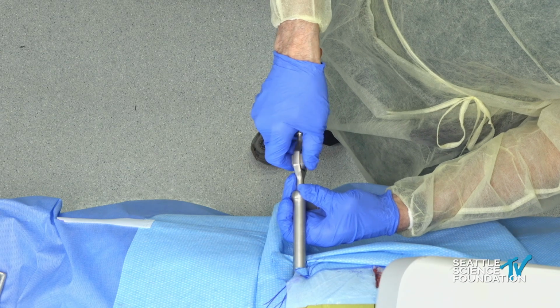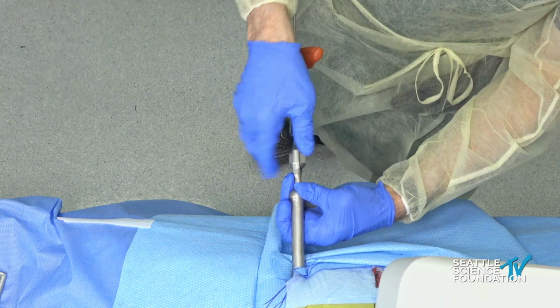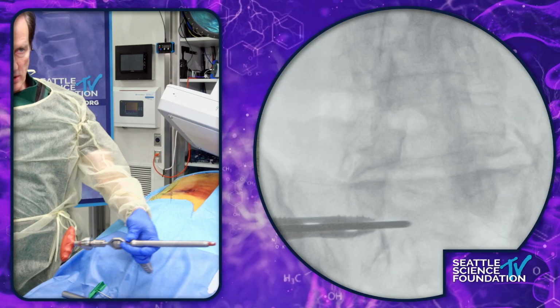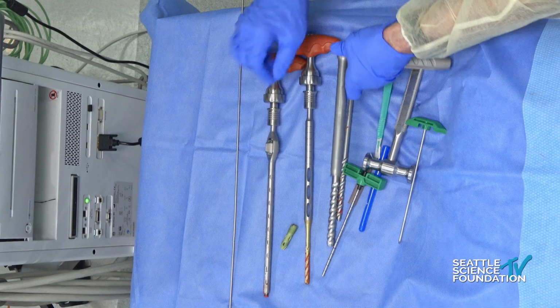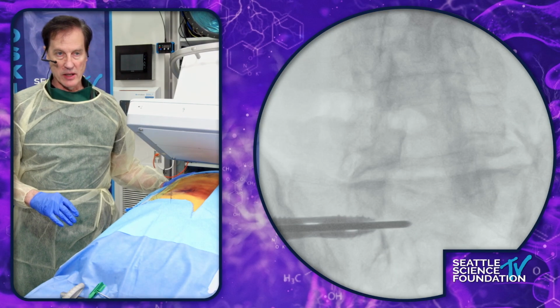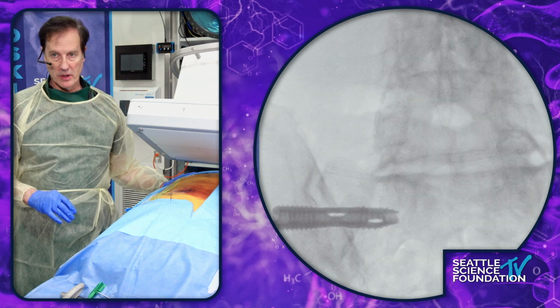So I'm going to disconnect here. I want to come back to that AP outlet view. Just arc back toward me. Everything comes out. We disassemble this. This is a long Steinman pin. This is the inserter. This is a working channel. And we'll come back and we'll take final views of the outlet and the inlet. Very nice.